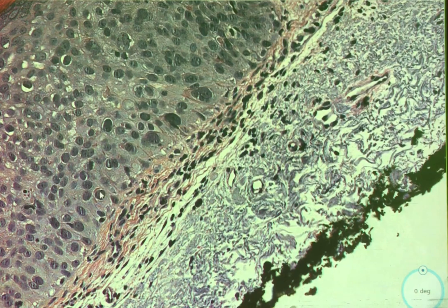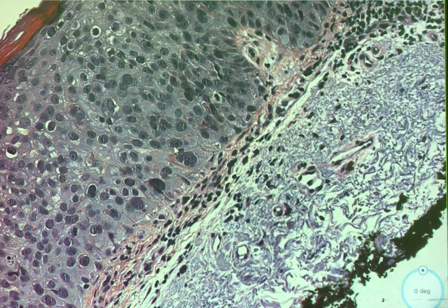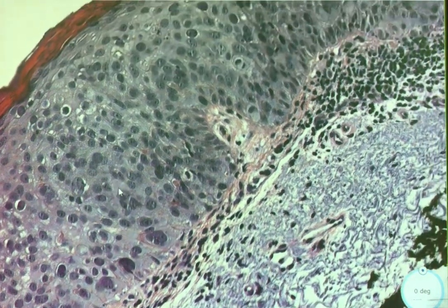Pleomorphism, can we call it? Yes, we can. Although, I usually like to use pleomorphism for, everyone's probably heard me use this analogy, when you go to the grocery store and you see potatoes and you have different types of gourds, whether it's butternut squash or zucchini, so pleomorphism is gourds. They're all different shapes, sizes, colors, whereas potatoes can be slightly different sizes, slightly different shapes, but they're definitely potatoes, right? So that's how I look at it, but yeah, this is kind of potatoes.